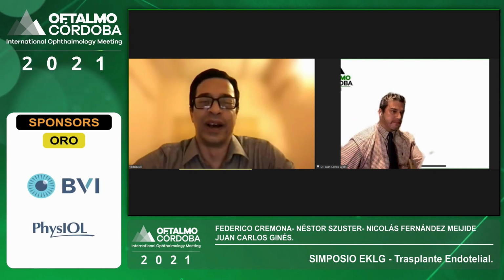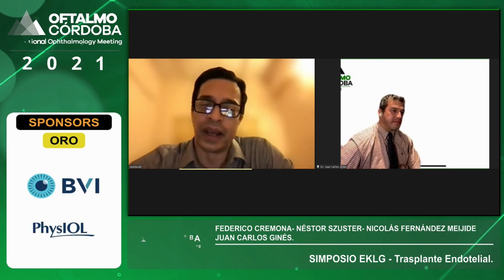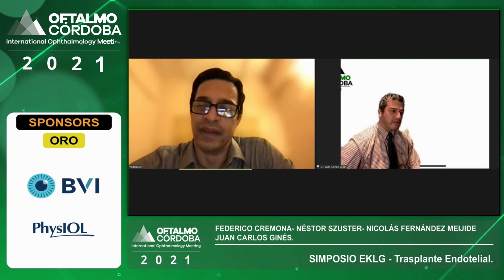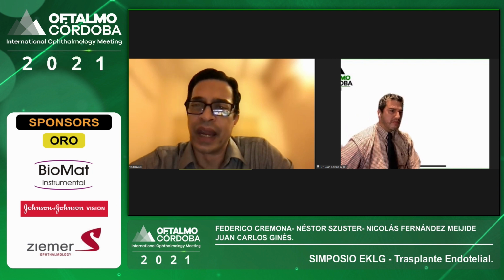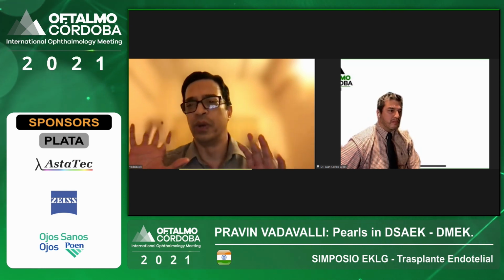Well, actually, in cases where the cornea has a lot of edema and you can't see very well inside the anterior chamber, a DSAEK probably would still be better. Additionally, where the anterior chamber anatomy is not very good, there are a lot of synechiae, pupil is very large, there again, probably a DSAEK would be better than doing a DMEK surgery. Also, a patient who can't lie down because you need to position the patient very well, you probably would prefer to do DSAEK surgery as compared to a DMEK.